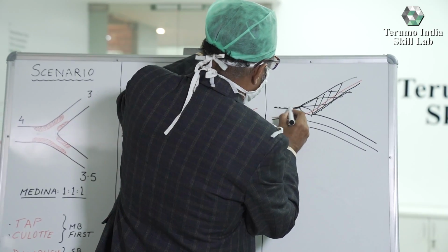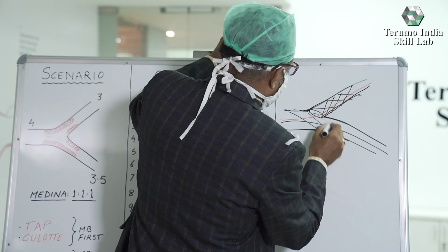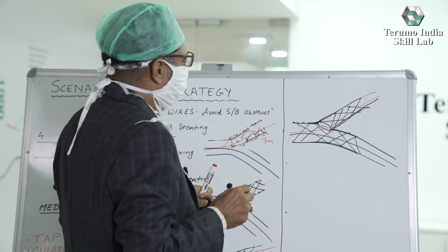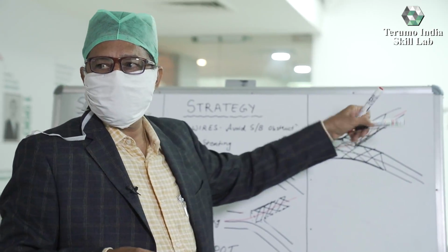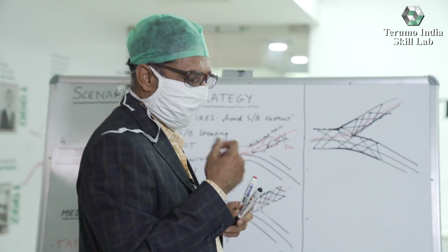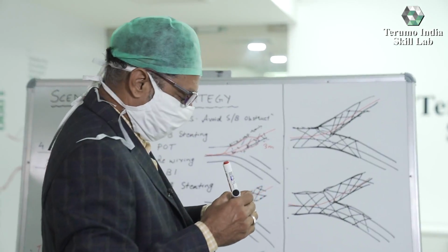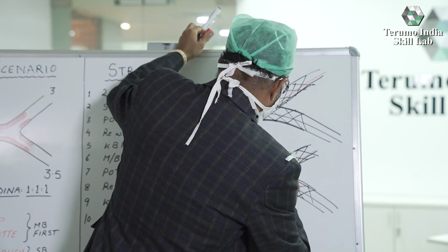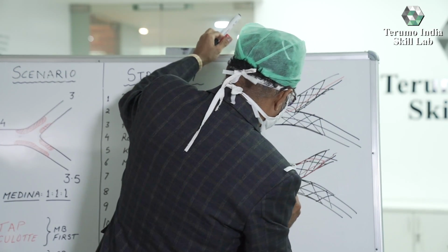So then the main vessel stent comes in. When you deploy the main vessel stent, you may or may not remove the side branch wire. In our case, we kept the side branch wire and gradually, carefully removed it. The main branch wire is already in position, and we do a final kissing balloon dilatation.